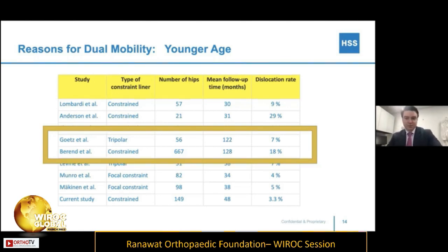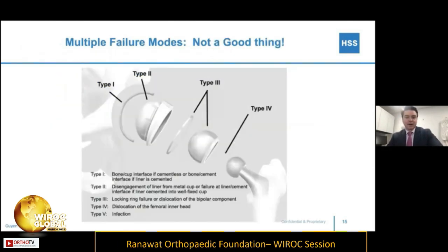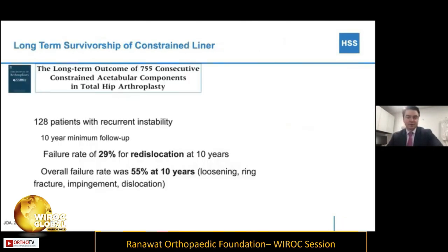There are multiple failure modes that we can talk about. But if you're younger and you need that constrained liner for 5, 10, or more years, that revision rate is going to go up over time. Why is that? Well, this was an article recently which categorized all the different types of failure mode. Anytime you have multiple interfaces and constraints, it's not a good thing. So this just highlights why that failure rate was so high.